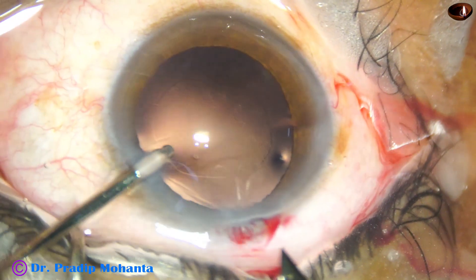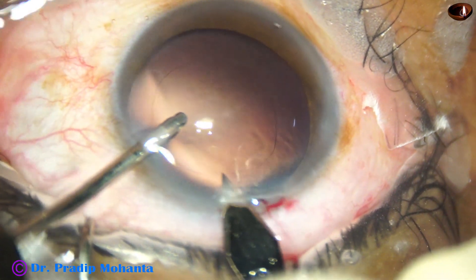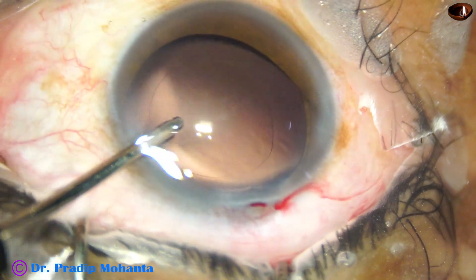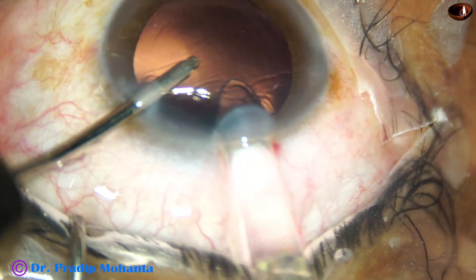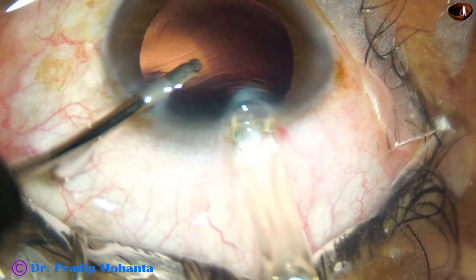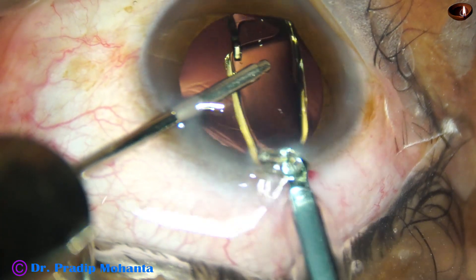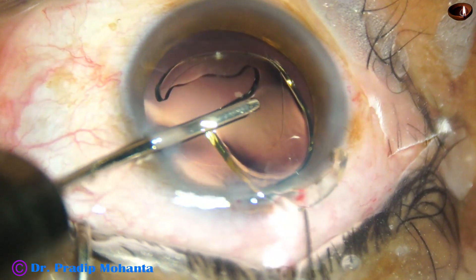Now this is a smart step — enlarge the wound a little bit more, one more cut. Now the lens will go. Yes, very nicely engaged, and here goes the lens. The irrigating cannula supports the anterior surface of the lens.